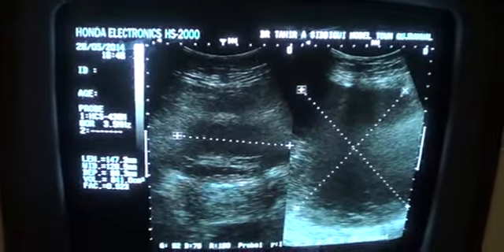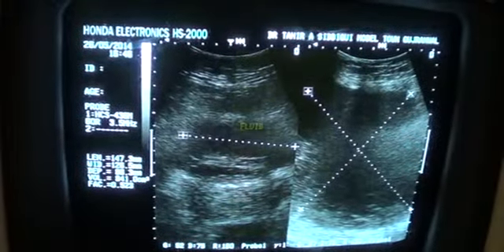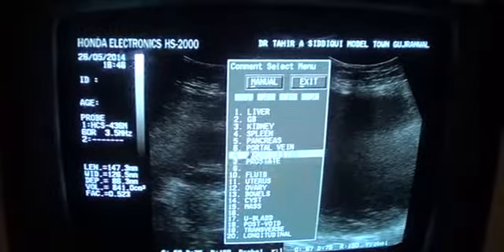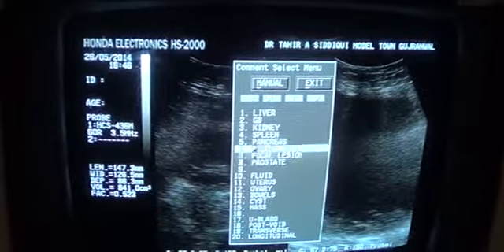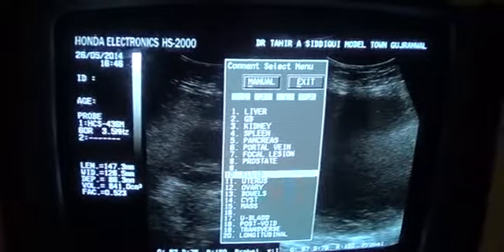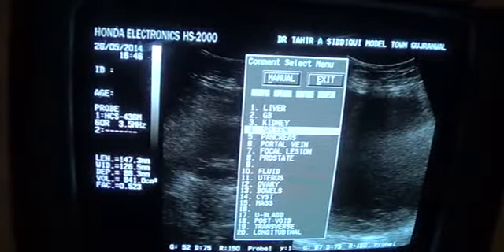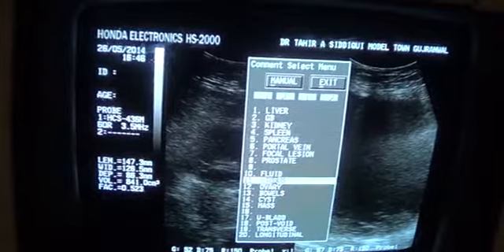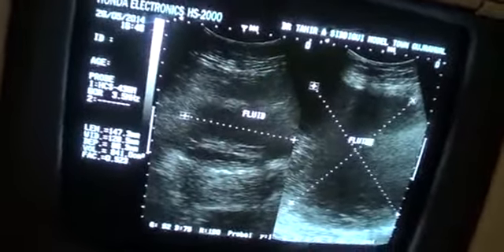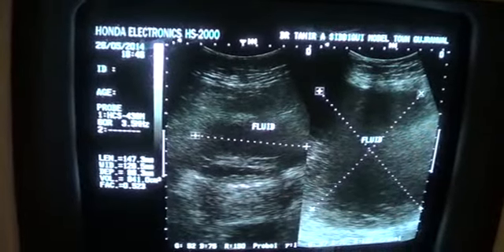It is approximately 841, and I tell you what, when this is going to be open, the volume is going to rise more than a liter. Now this portion is only that of the fluid. It's not that of the total abdomen.